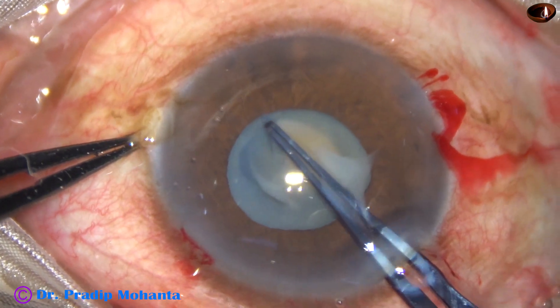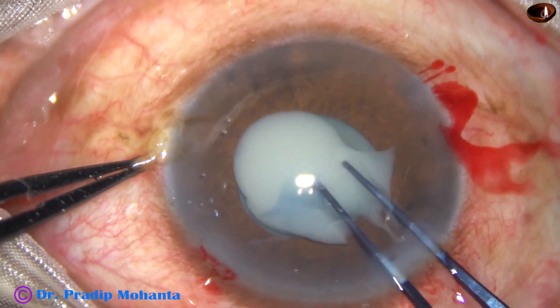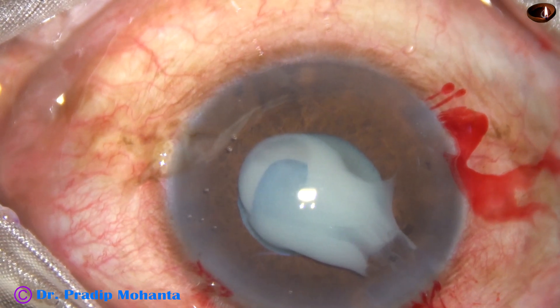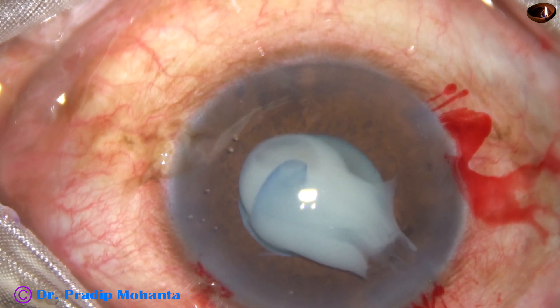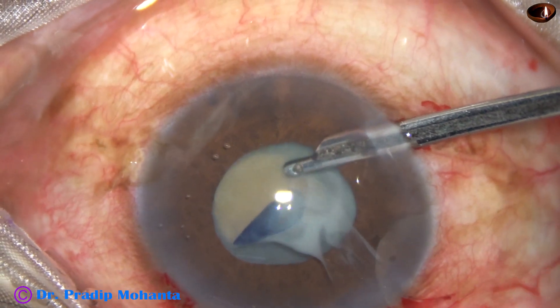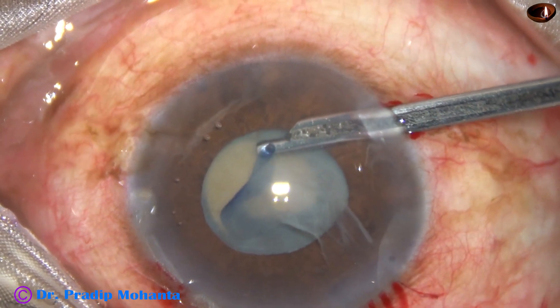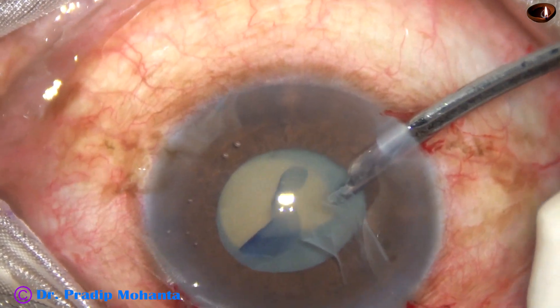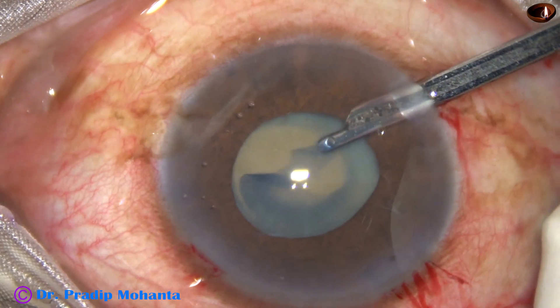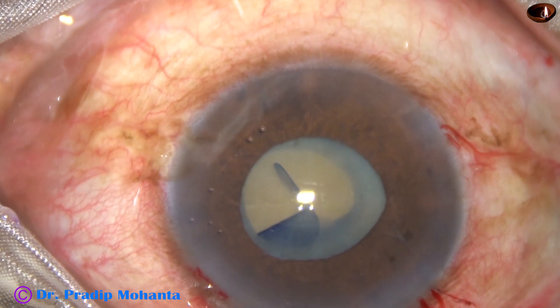Going anti-clockwise. When I come to about 3 o'clock, the milky fluid is so much that I can't see well. So I have to aspirate some milky fluid, inject visco, and then proceed again. Through the side port at 8 o'clock, I am aspirating the milky fluid — because if I aspirate through the main incision, the capsular tag will come out through the main incision and the rhexis will extend to the periphery.